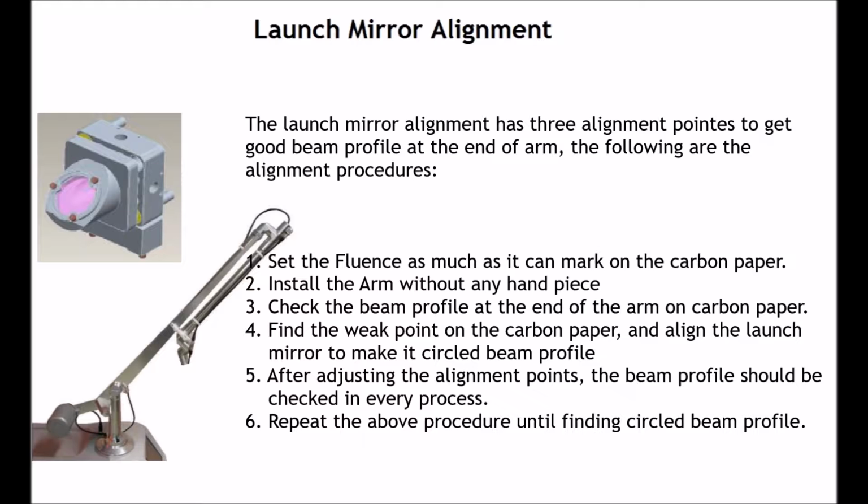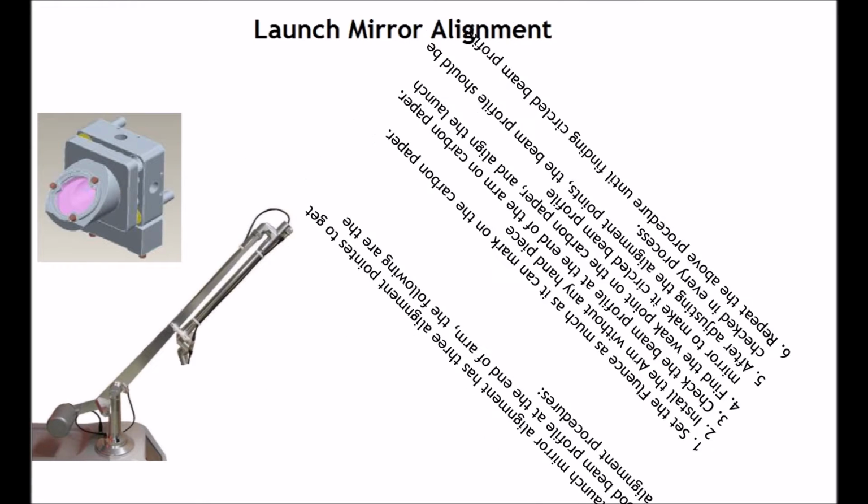4. Find the weak point on the carbon paper and align the launch mirror to make it circled beam profile. 5. After adjusting the alignment points, the beam profile should be checked in every process. 6. Repeat the above procedure until finding circled beam profile.